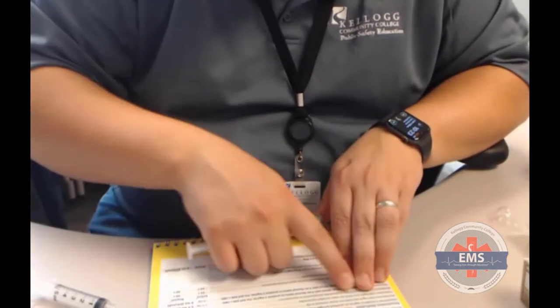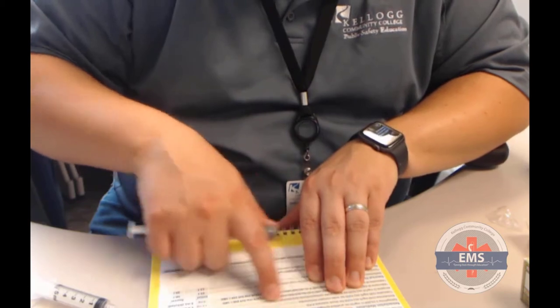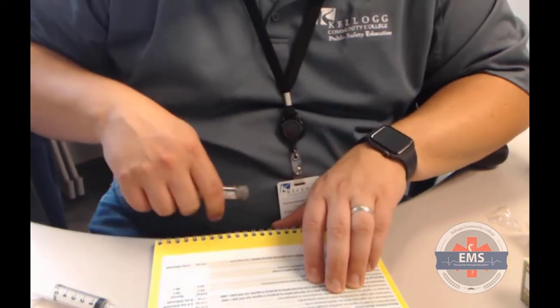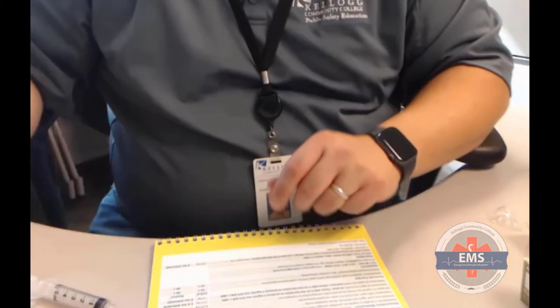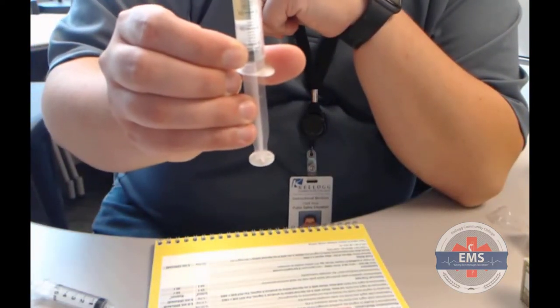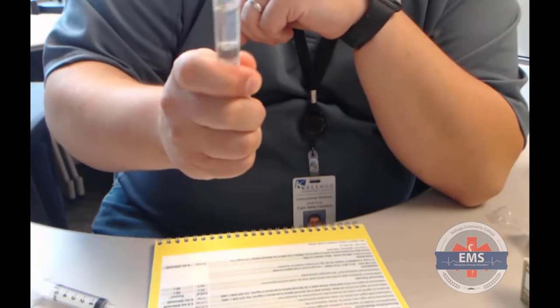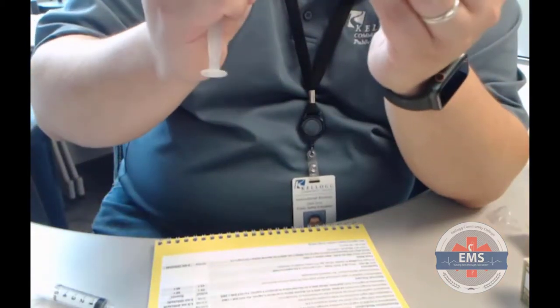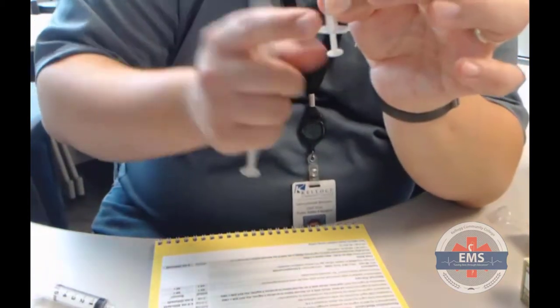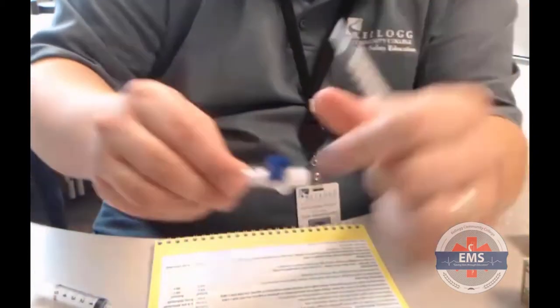I'm going to reference my card here. It says I'm dealing with a patient where I'm going to be giving a proper lidocaine dose. I need to give 0.7 milliliters to this patient. Giving 0.7 milliliters out of a pre-filled syringe is very difficult to do by just squirting out some of the medication. I really have to make sure that I'm using the proper dosing. This is where I can easily draw up 0.7 milliliters in a 1 milliliter syringe. To do so, it's relatively simple.